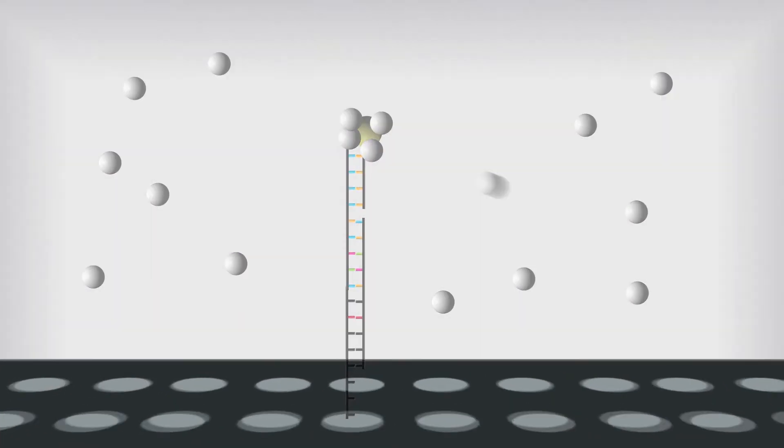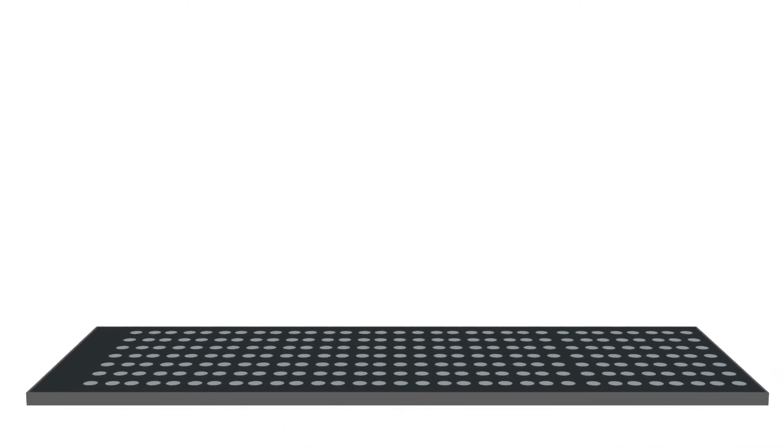This method analyzes slides covered in spots, called nanogrids, to detect the presence or absence of targets. Each spot contains a strand of DNA, or probe, complementary to the various targets of interest.